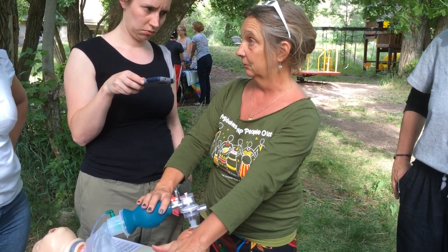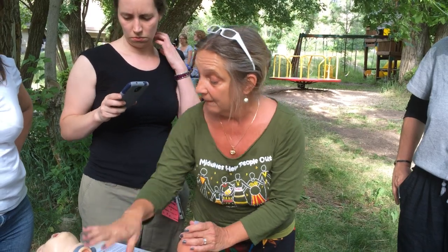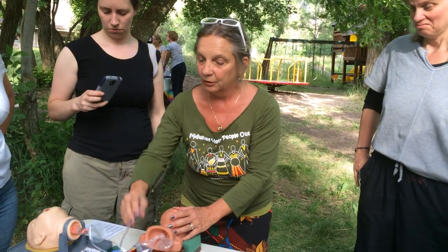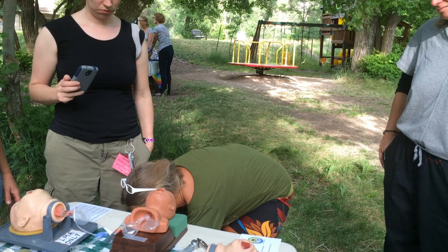This works great with this model because this model was made for this. I have made these models work with the LMAs, even though that's not what they're made for. So, in the use of an LMA, LMAs come.